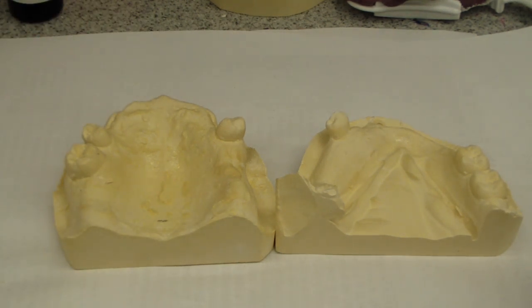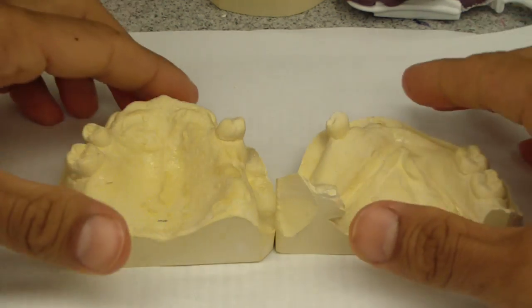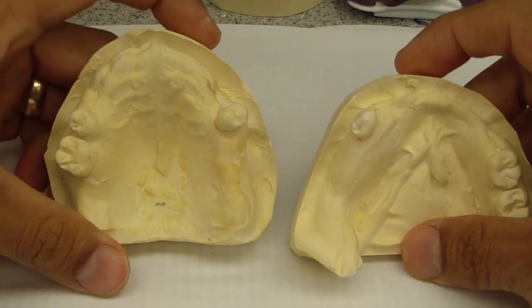Hey folks, Ashley here at AllThingsIndustry.com. In front of you, you see two diagnostic impressions or study models, and this is of Aaron.